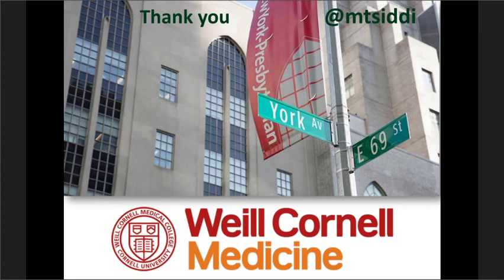Right. So I would say collect as much as you can at the time of procedure. If it's a solid lesion, certainly you can put it all in there, but make sure you get at least 3 or 4 passes. If it's a cyst, then that makes it easy. You can submit all of it for ThinPrep, and then subsequently you can prepare one ThinPrep slide out of it. And if there's residue left, that can go in for a cell block preparation. So that is what I would recommend. And I think for cysts, that's basically the route we have gone here for the most part.